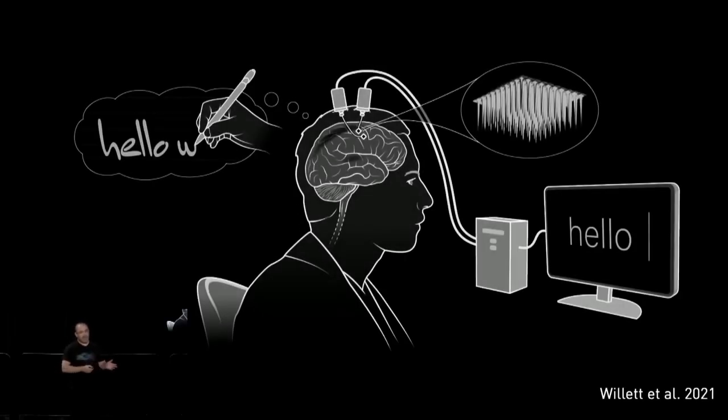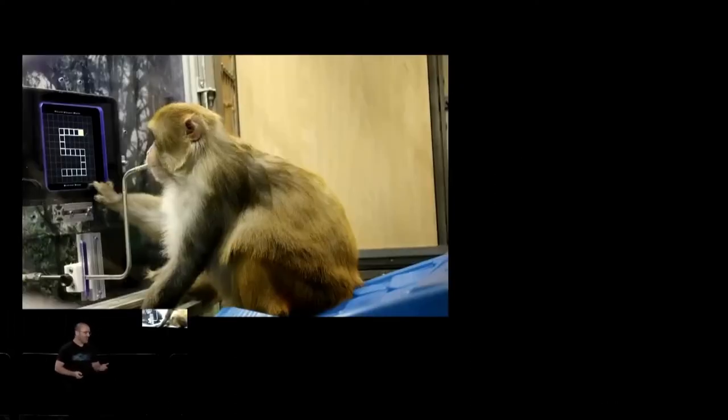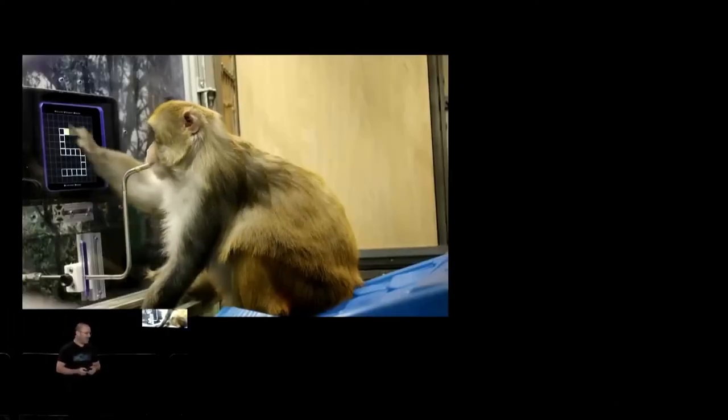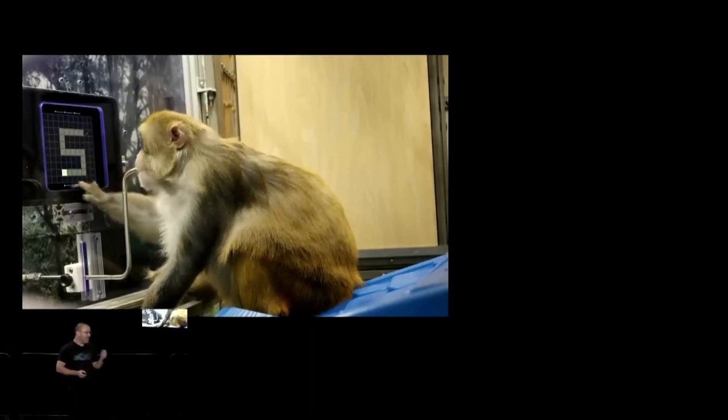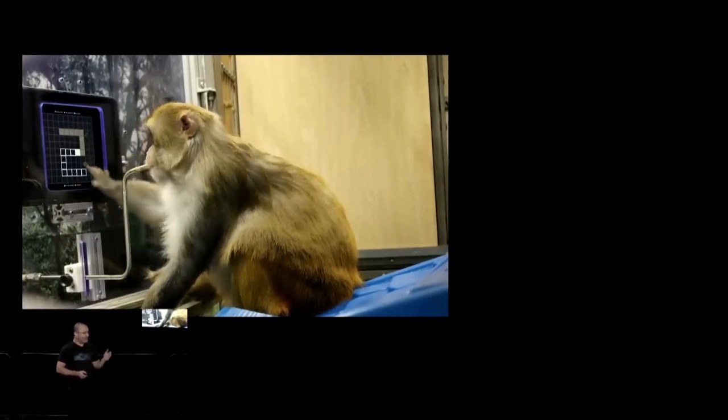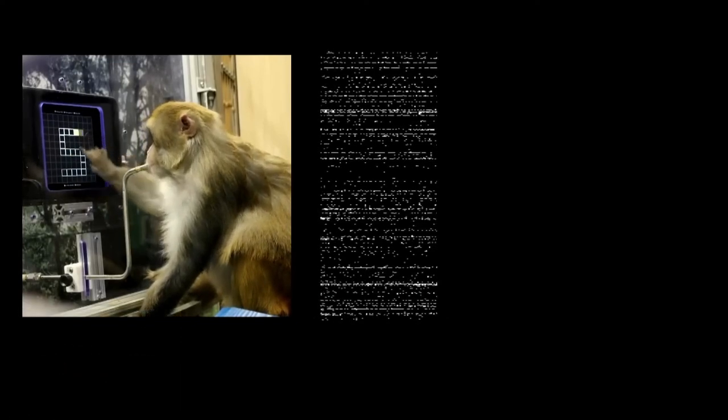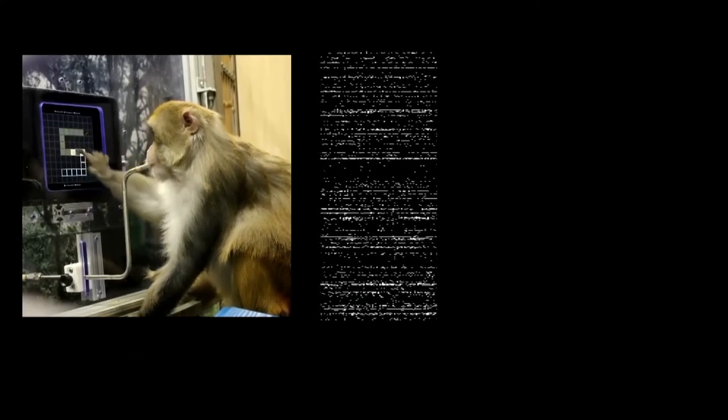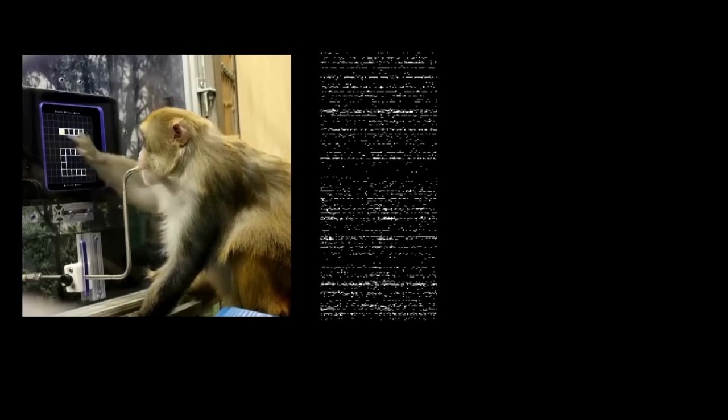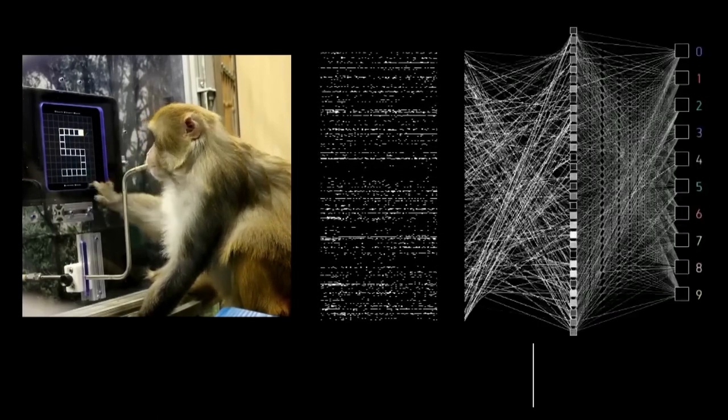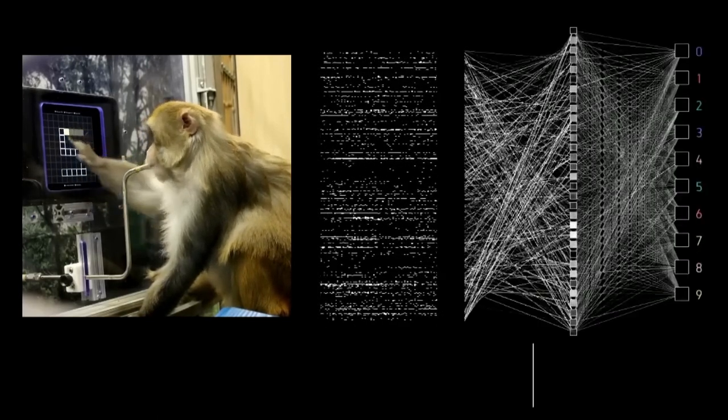We started this project with our monkeys, but of course they don't know how to write. To mimic writing, we trained Ranger, one of our favorite monkeys, to trace digits on an iPad. Here you can see him tracing the digit 5 and the digit 2. Then we recorded his neural activity with the N1 device. But now, instead of decoding the cursor velocity, we decode in real-time the digit that he's tracing on the screen.